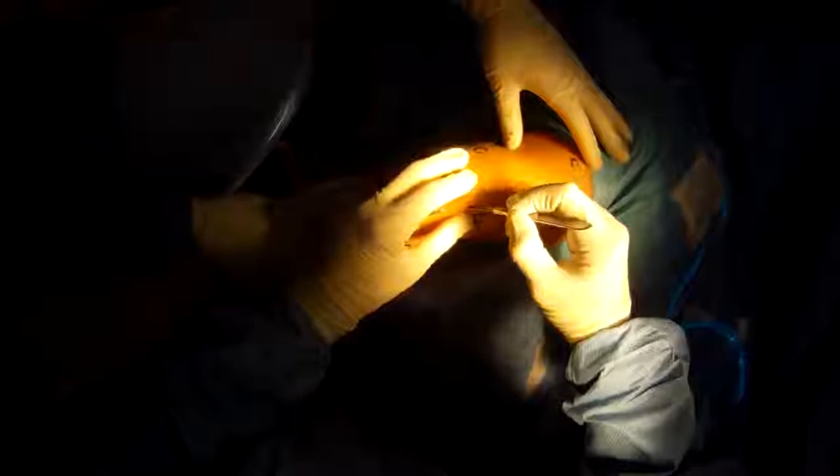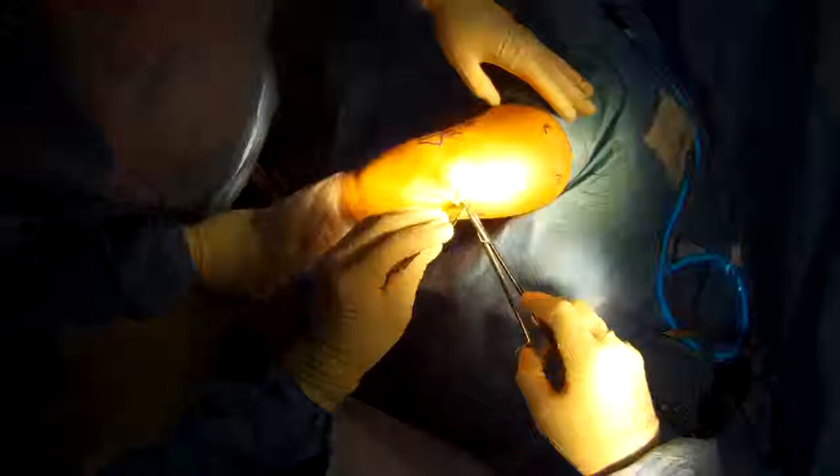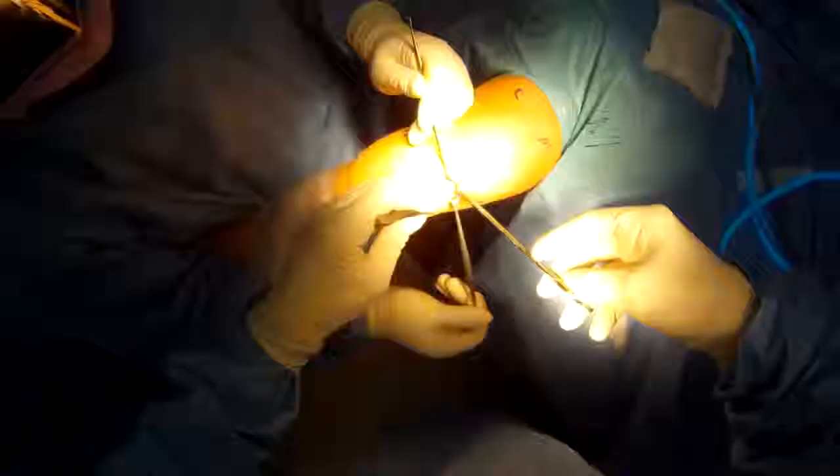Posterior elbow release. Patients had trauma and cannot fully flex the elbow because the joint capsule, or the balloon around the joint, is scarred in the back. So we're going to release it through a small open incision.